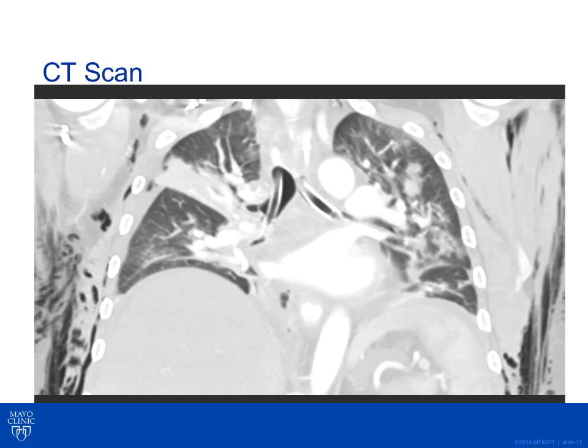A CAT scan was performed with bilateral mainstem bronchial intubation. This can be seen best on the coronal view, where each endotracheal tube is seen with the positioning of the balloon cuff. The cuff can clearly be seen to occlude the right upper lobe takeoff, causing some collapse and atelectasis of the right upper lobe. However, the remaining lungs appear well ventilated.